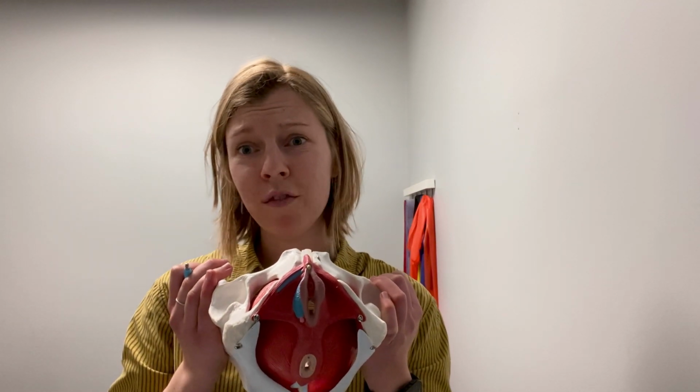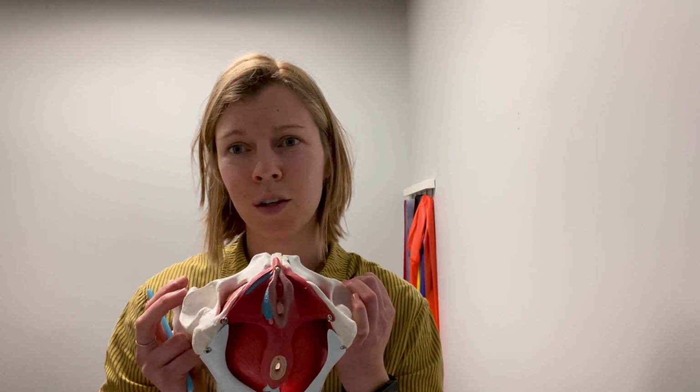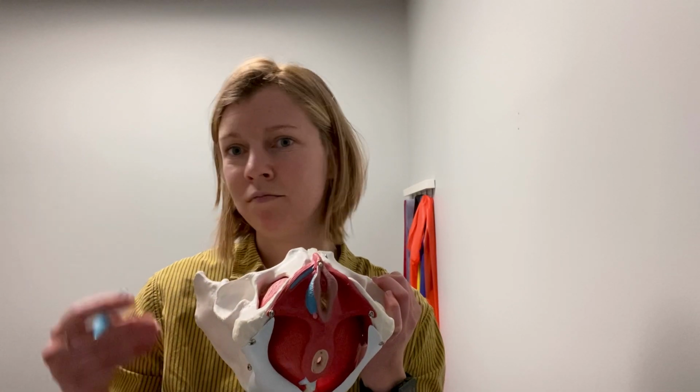Now, I will say these are not painful spots. If you've ever had dry needling before, where you've had it was probably more painful than some of these pelvic floor spots. So they're not too painful. We don't often use stim, and we don't often use a pistoning technique with these, as they are a little more sensitive. Needle in, needle out.